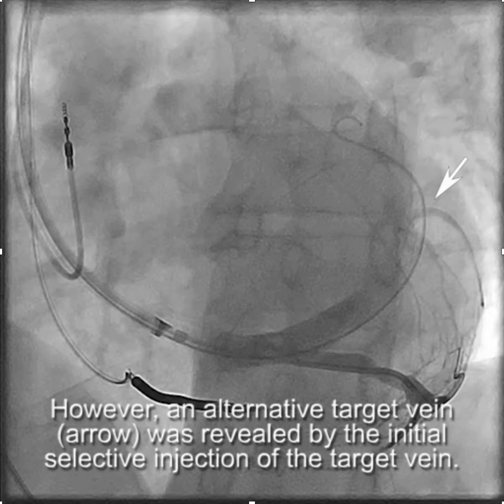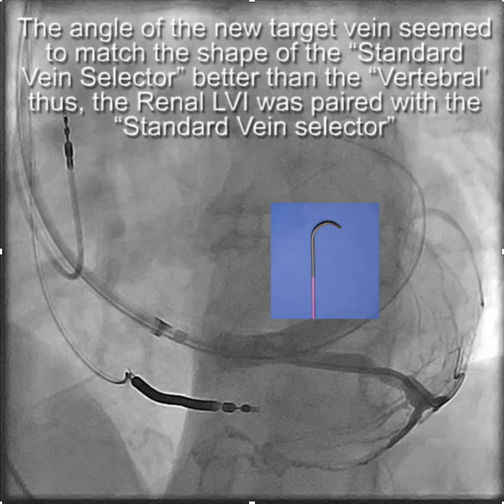The goal then was to get the LV lead into this smaller lateral wall branch up here. You'll notice that the angle of the takeoff of this branch actually matches the angle of the standard vein selector better than the vertebral. So this time we decided to pair the renal LVI with a standard vein selector and go after this side branch.